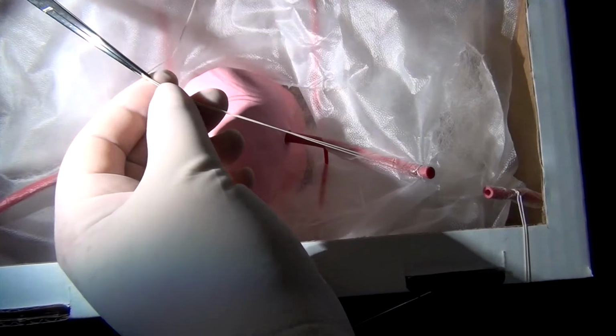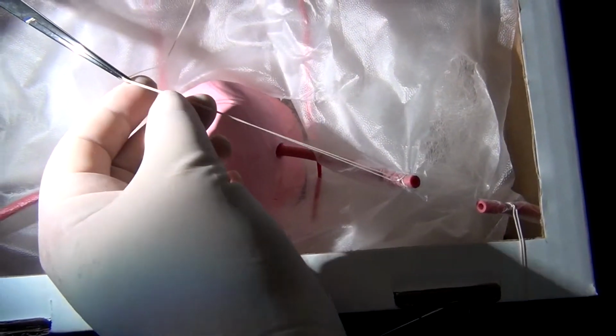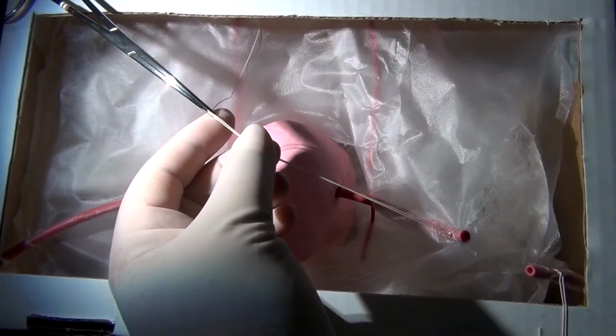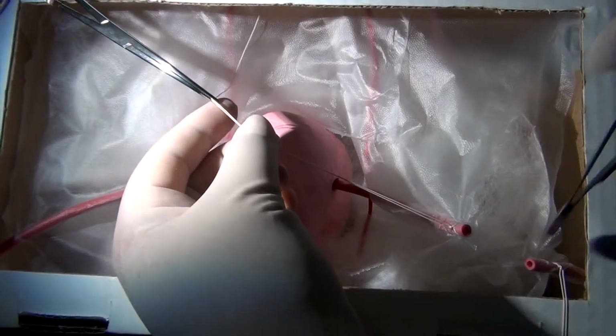And so I am going to take my fingers. However, you can also do this with a suction. You could do it with the back handle of a hemostat or with scissors.